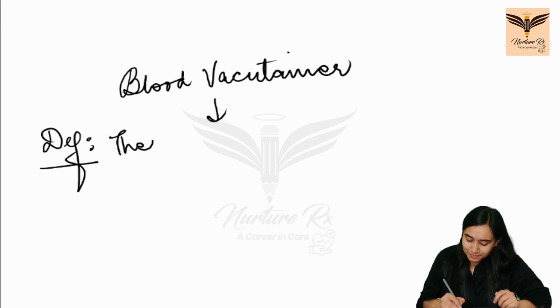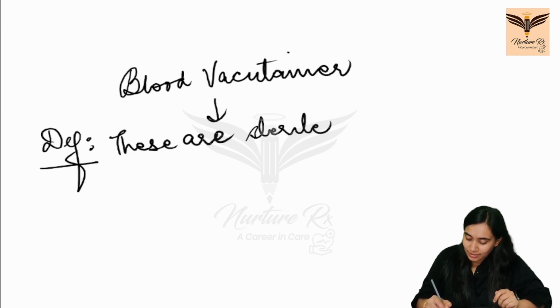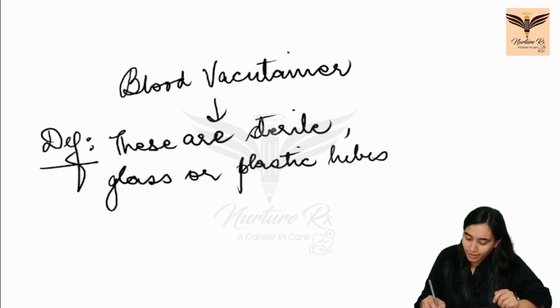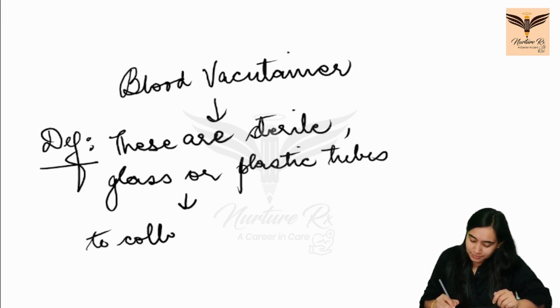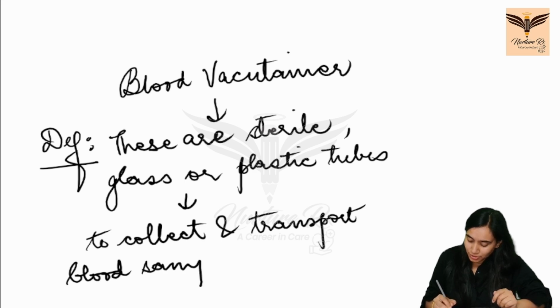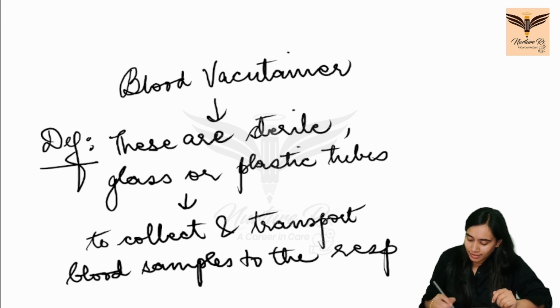So these are sterile, and what are they made up of? Glass or plastic tubes. And what are they used for? To collect and transport blood samples to the respective labs.